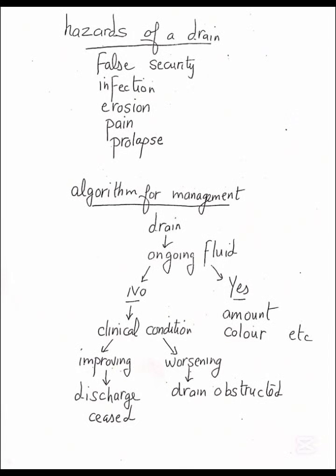Increased pain, fever, or abnormal fluids may indicate complications. Check for any drainage obstruction. This might require flushing the drain or imaging to confirm the blockage. If the drain is no longer functioning or the issue resolves, cease drainage and consider alternative treatments.